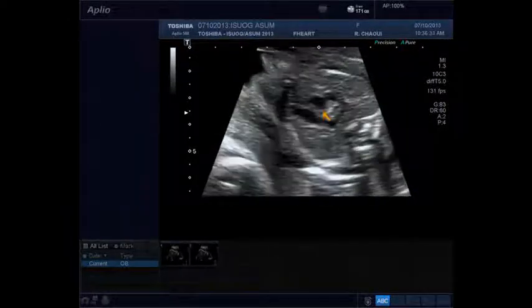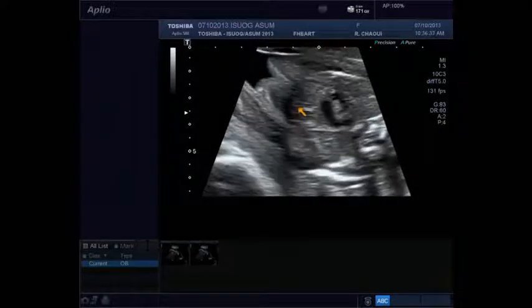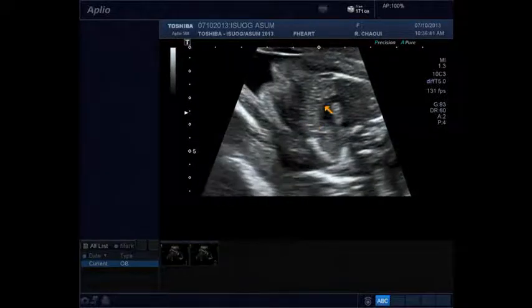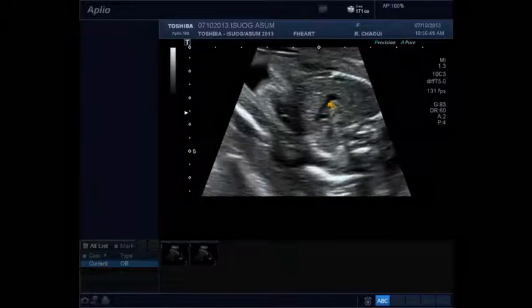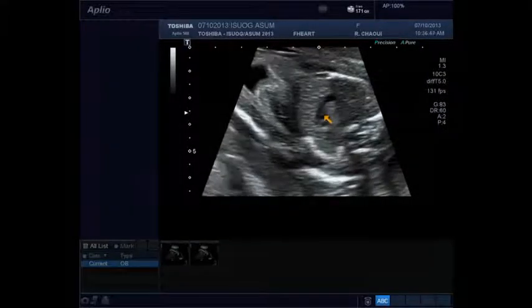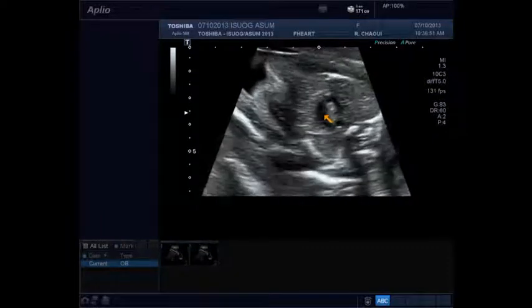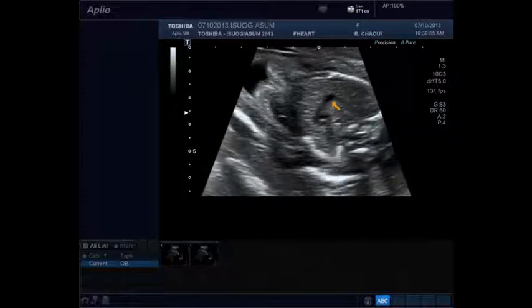From this plane, if you go for even higher resolution, you see the two lung lobes, and just in front of the three vessels here, this is the thymus, well seen. And in an even higher plane, you recognize an oblique vessel, and this is the vein called the innominate vein or the brachiocephalic vein. We published with Alfred and with Elena last year a paper on this condition, you can refer to it in the White Journal.